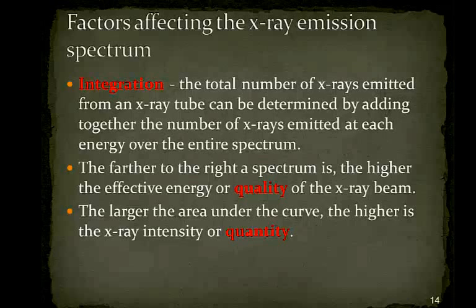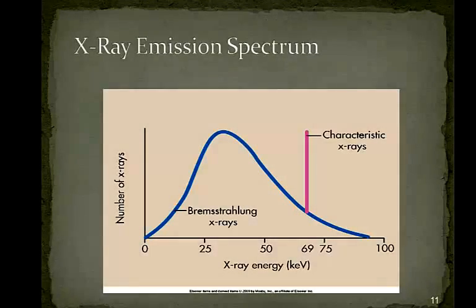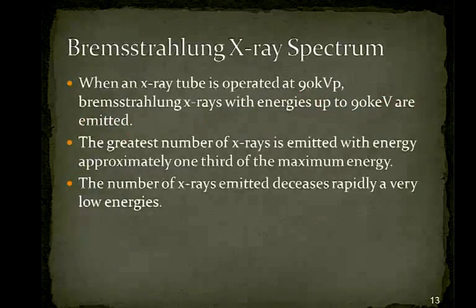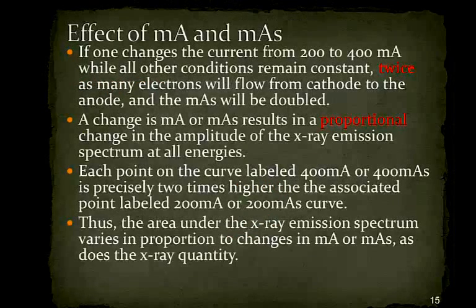So again, when we are moving to the right, as we notice, the x-axis here is X-ray energy. When we look at the y-axis, that is increasing. We're increasing the number of X-rays, or the quantity. So again, that is the X-ray emission spectrum.